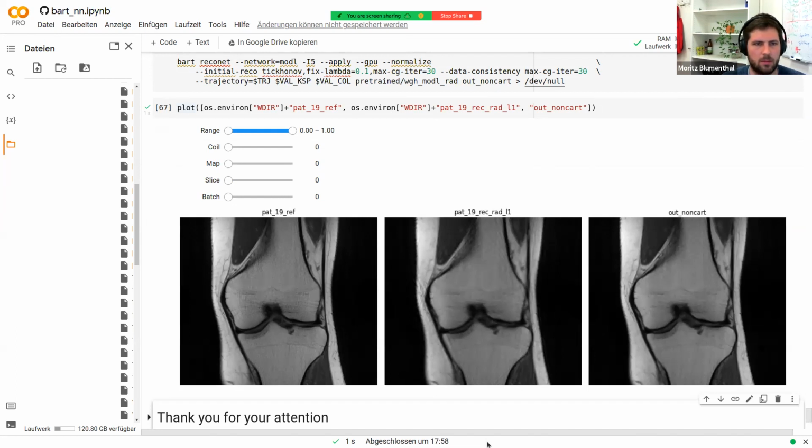Okay. There are a couple other questions. There was a question about whether or not you've assessed quantitative maps after using the reconet command. So if I understand the question is, if you have data that follows, for instance, a T2 decay curve, have you looked at the quantitative values of the maps that come out? Yes, we started working on that, but I think that will be presented by someone else. Okay, so sounds good. Keep it secret until ISMRM. Okay, looking forward to that.